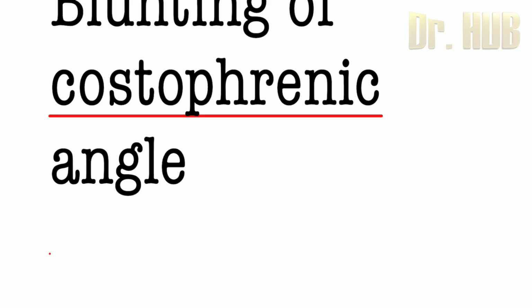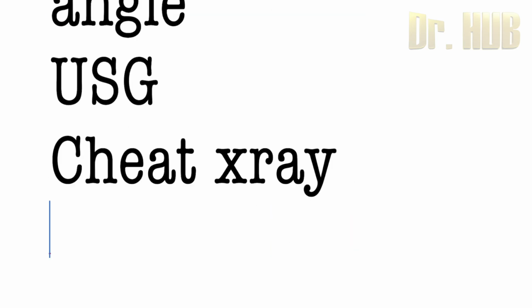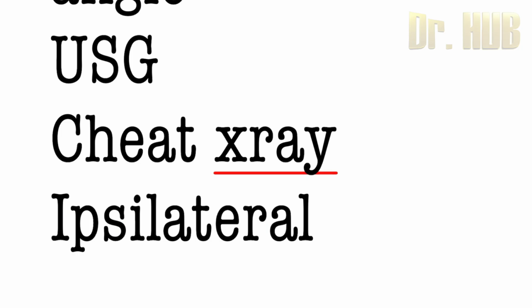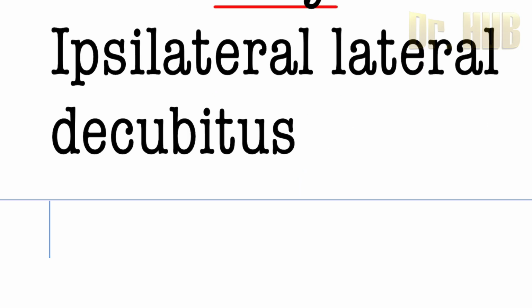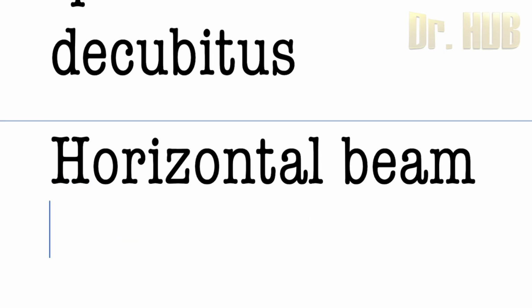Next comes the most sensitive investigation. This is nothing but the USG. The most sensitive chest X-ray view will be the ipsilateral lateral decubitus, with a horizontal beam.